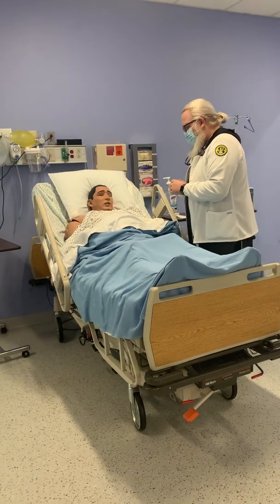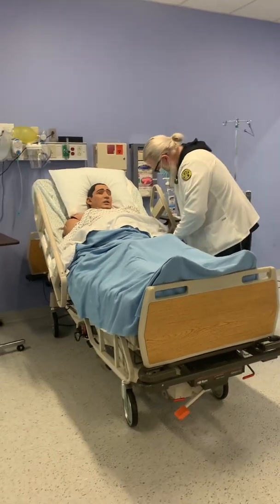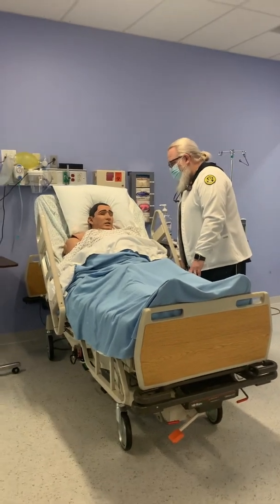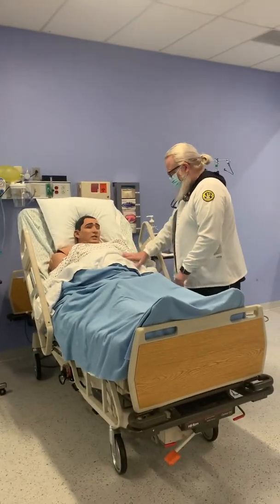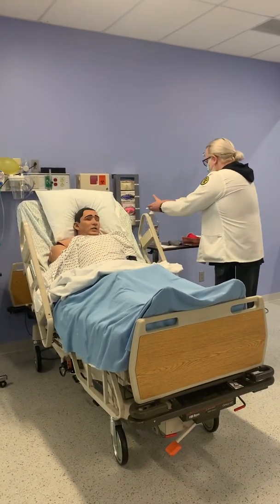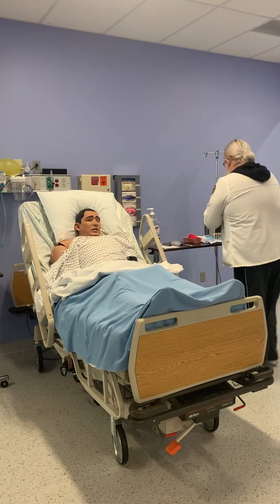Okay, good. We're gonna put your head up, high Fowler position. You feel okay? Okay, good. Just gonna bring your blanket down. I'm gonna get all my materials first. I'm gonna wash my hands. Hand hygiene.